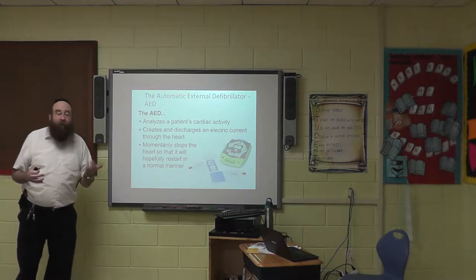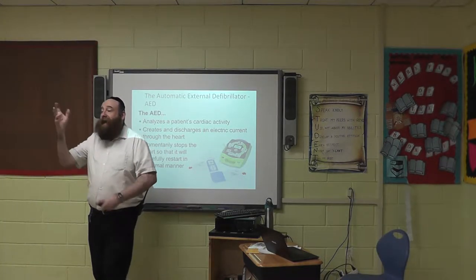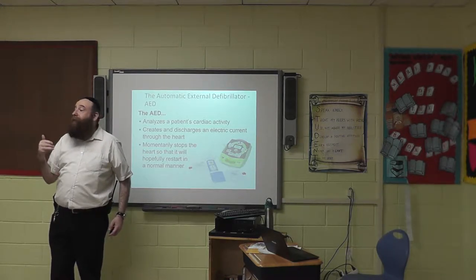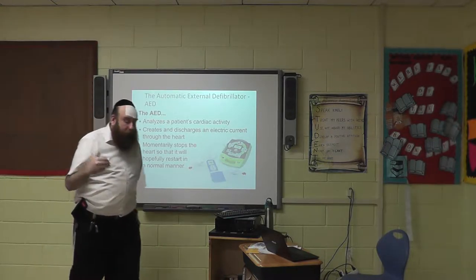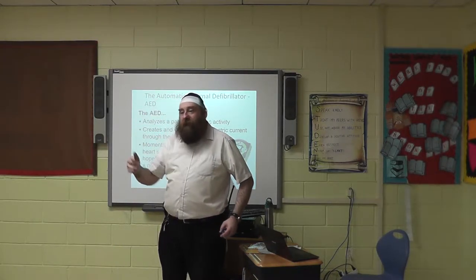Defibrillator. Let's talk about that word. Because it's quivering and you're stopping. Right, so this action of the heart, the quivering, we said is called fibrillation. That's just general. Fibrillation. We want to apply some electricity that will defibrillate. What does that mean?